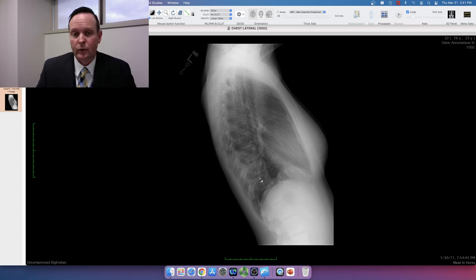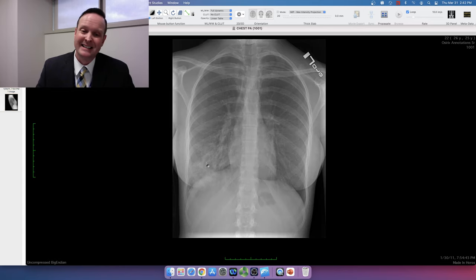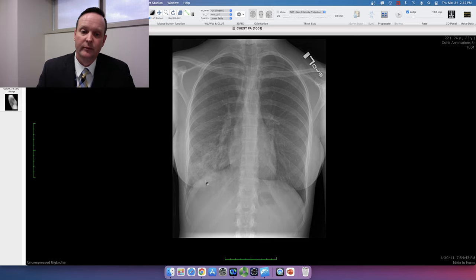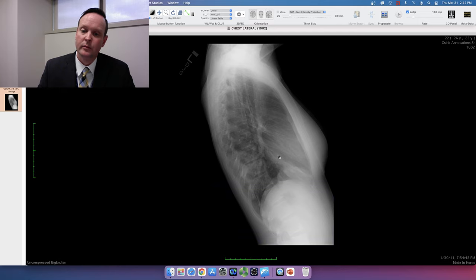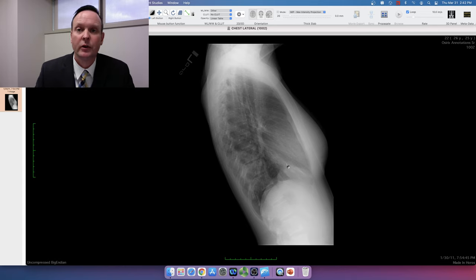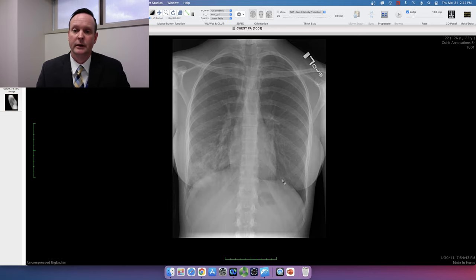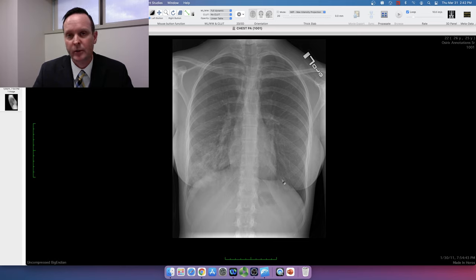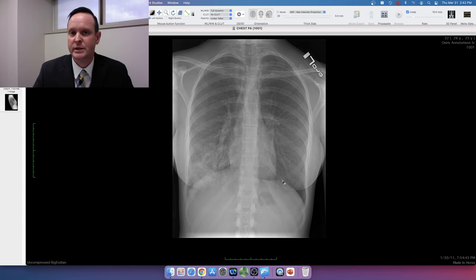I've localized it to the right lower lobe. Now I'm going to characterize it: it is patchy, I've got airways passing through it with branching air-filled components — air bronchograms — and on the lateral it approaches and stops at the oblique fissure. These are classic qualities of consolidation. In context, this is an acute focal consolidation in a younger patient presenting with fever and cough, consistent with a community-acquired pneumonia.